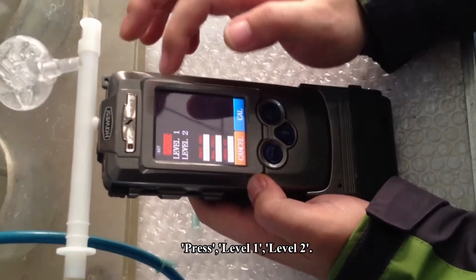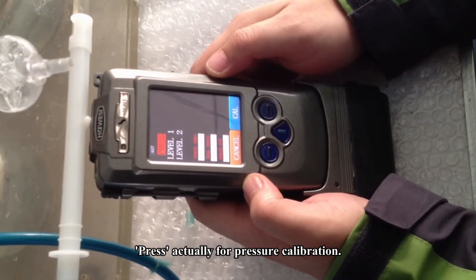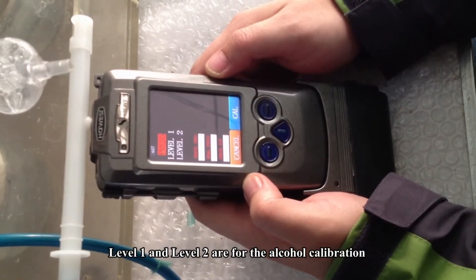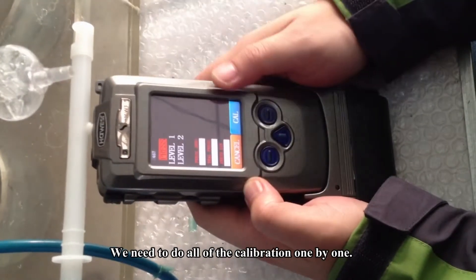There are three options: Press, Level 1, and Level 2. Press is actually for pressure calibration. Level 1 and Level 2 are for the alcohol calibration. We need to do all of the calibration one by one.